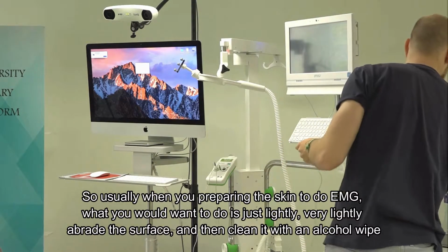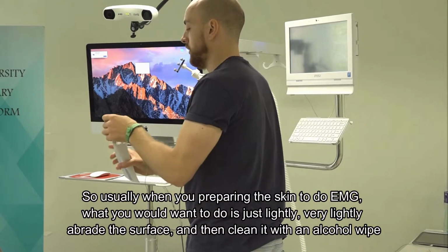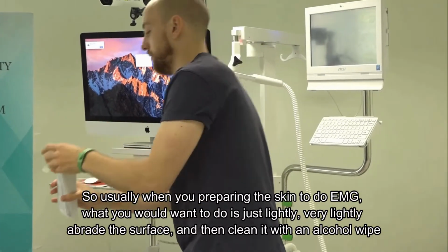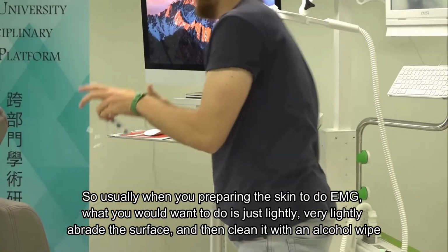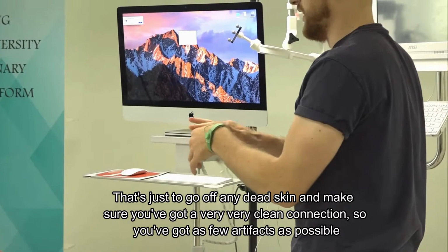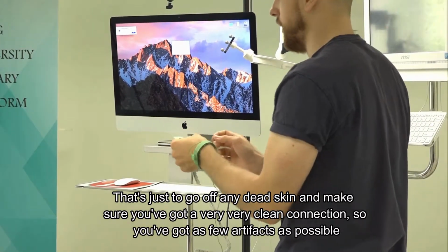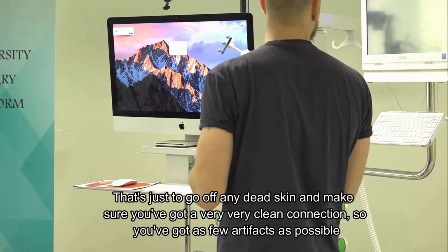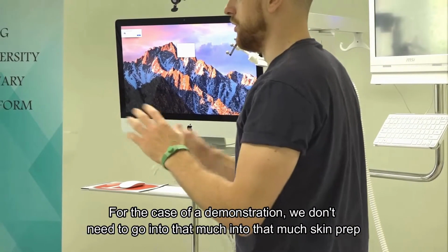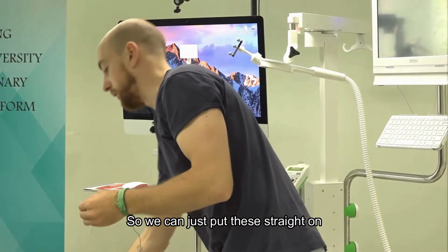So usually when you're preparing the skin to do EMG, what you'd want to do is just very lightly abrade the surface and then clean it with an alcohol wipe. That's just to get off any dead skin and make sure you've got a very clean connection, so you've got as few artifacts as possible. For the case of a demonstration, we don't need to go into that much skin prep, so we can just pop these straight on.